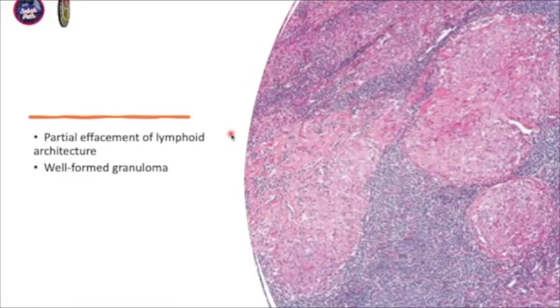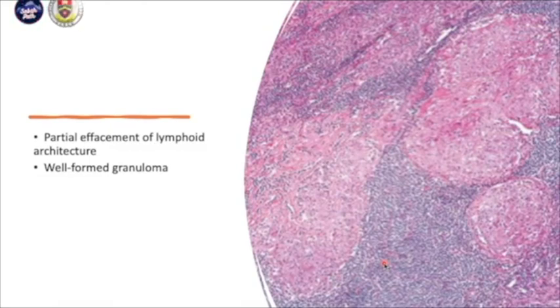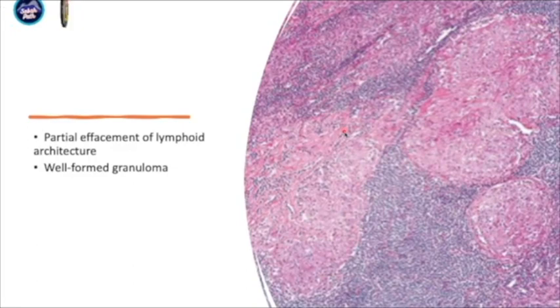If you look at the histological slides of this pathology, you can see there's a partial effacement of lymphoid architecture. The normal lymphoid architecture has a well-defined, distinct cortex and paracortex area. If there is a disruption of this architecture, we call it effacement. If there is total loss, we call it total effacement; if partial loss, we call it partial effacement. So there is a partial effacement of lymphoid architecture by this well-formed granuloma.